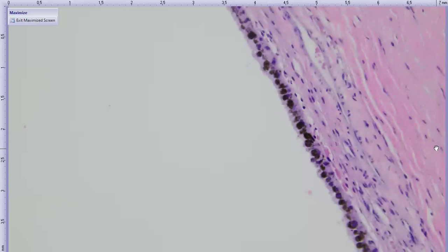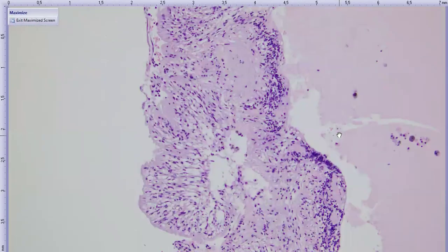You can see that the RPE is hypertrophied. This will be referred to as tombstoning by a lot of people. So you can see how these look like a row of tombstones with how plump and hypertrophied they are, which is also another indication that this is a true in vivo retinal detachment. And then if you look at the neurosensory retina itself, it's pretty atrophied in terms of the outer layers. So you have a thin outer nuclear layer and basically no photoreceptor segments to speak of.